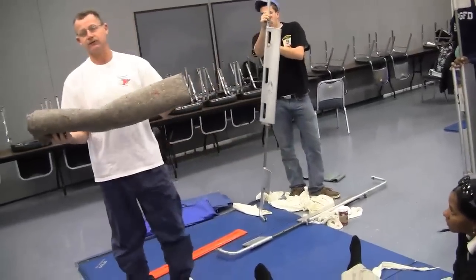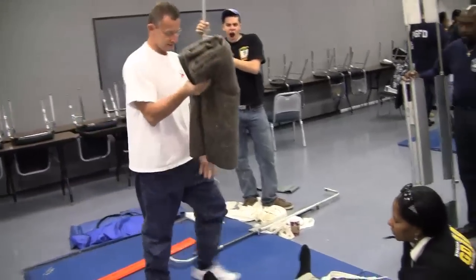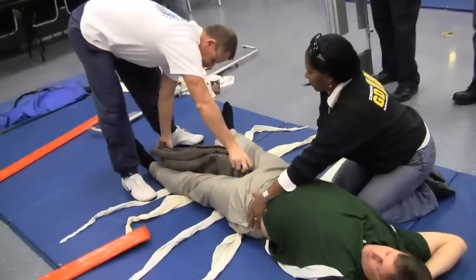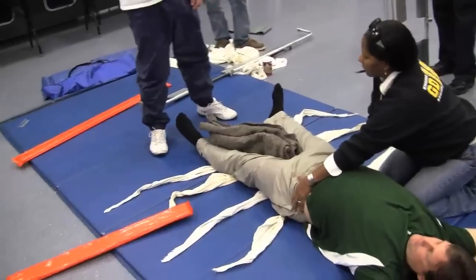Or you can unfold it however you choose and make it thicker. In this case you just take it up — put it up and put it across as far as it'll go. Now she's going to hold his hips, and we're going to have to bring his legs together.